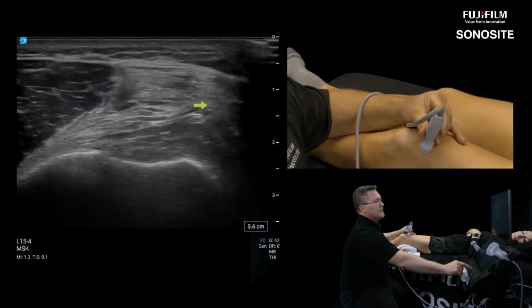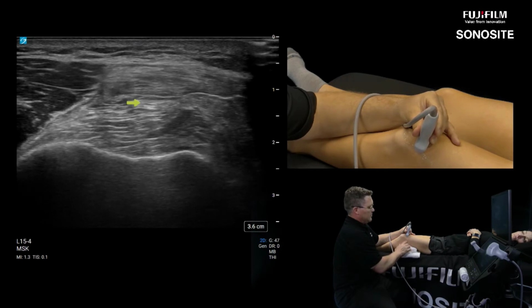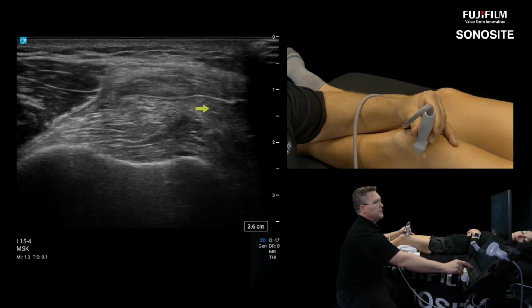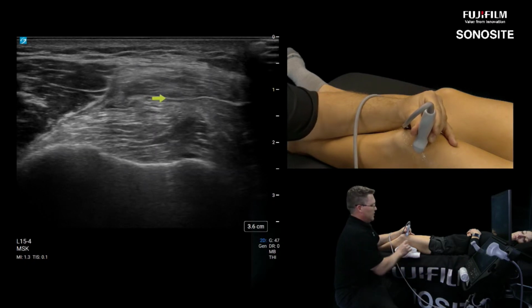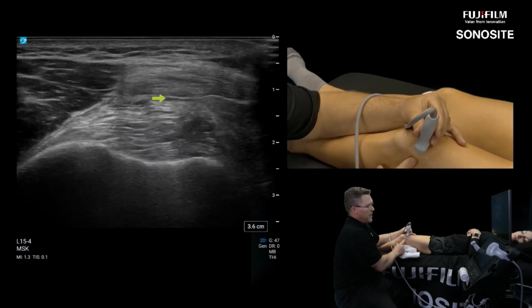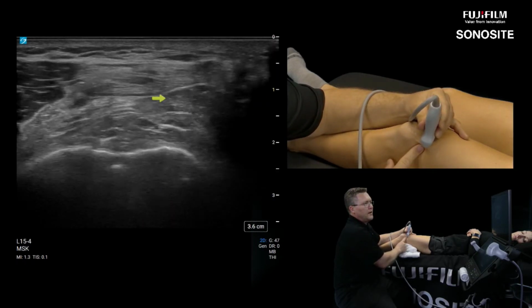And I still don't see it here in short axis very confidently. But if you palpate the IT band and just poke a little above it with your finger, we're causing this medial lateral motion of the prefemoral fat underneath the quadriceps tendon here, and we're going to identify that synovial recess right there where my arrow is. And that's just one other way to identify it. If I bring my probe out even more laterally, I can sometimes see a joint effusion wrinkle up over there laterally, but not today.